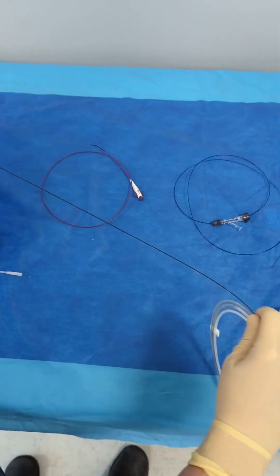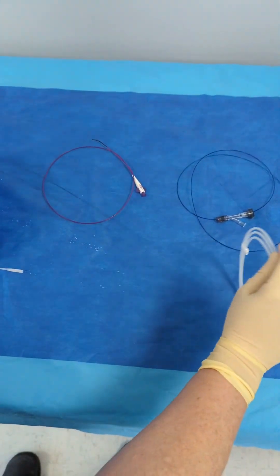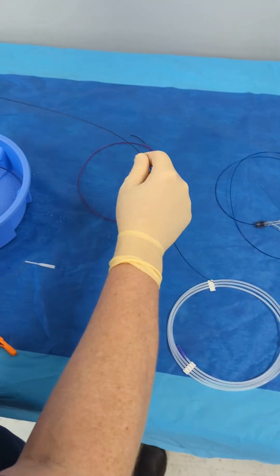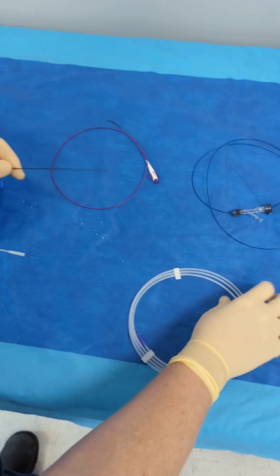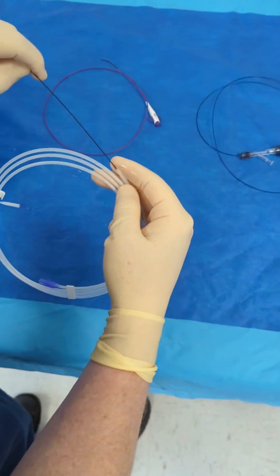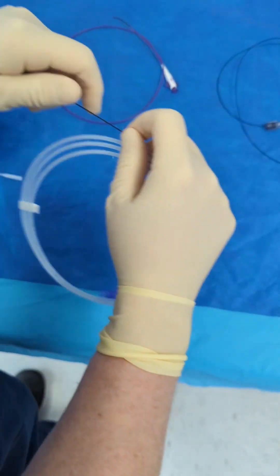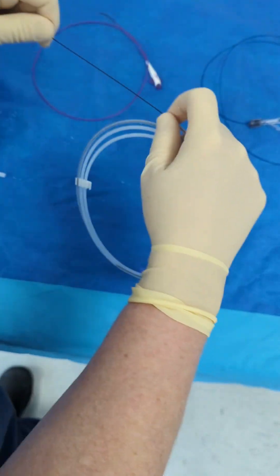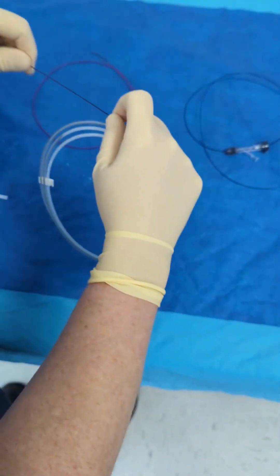So the first thing I do is take off the cheater and take it out past the dock. So when I re-hoop, I don't have to re-hoop through the cheater. I just put my finger on and push and pull. This is what I do for an O35.